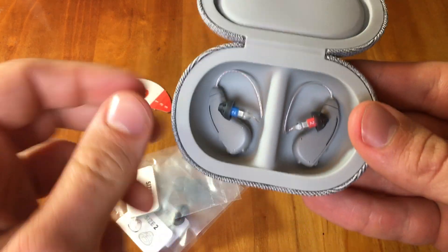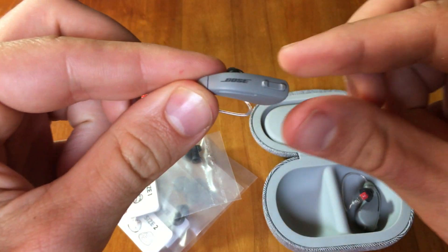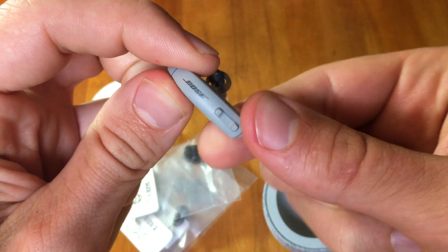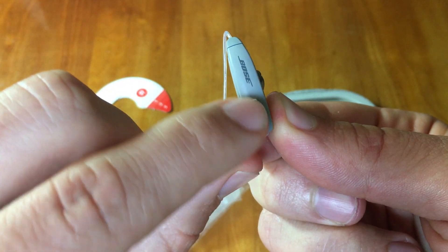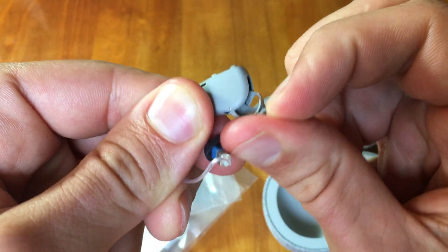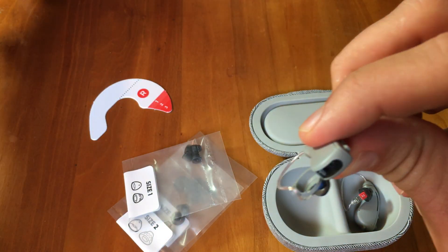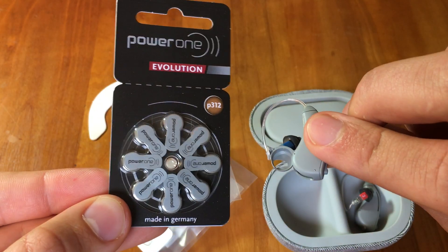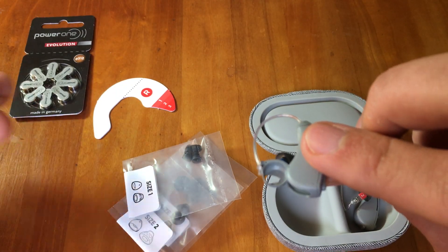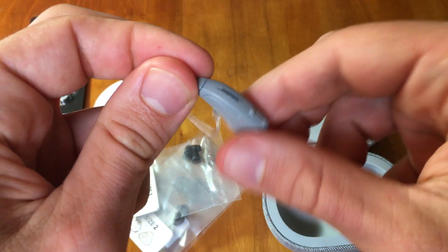Looking at the hearing aids themselves — I'm holding the left ear. You can see the nice Bose label right on the casing of the device. There's an up and down button here, typically used to change the volume. We're going to open up the battery door, where those size 312 batteries go. You take the tab off and then insert the battery into the hearing aid — that's how you get the power to keep the device running.